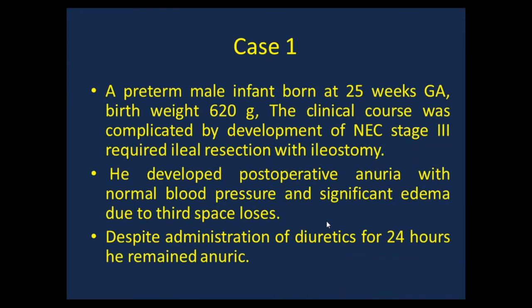So I like this approach. I mean, do you think that will address the criticism for abdominal NIRS? Many times people say with abdominal NIRS, you don't know what tissue you're measuring, right? And that's exactly the common criticism, right? Yes. So we are compensating for that, because one of the criticisms, as you mentioned, is that when you apply NIRS, you are not sure if the NIRS infrared wave is passing through poop or fluids or peritoneal fluid. You have to be sure that the ultrasound is giving you an impression that you are exactly over the tissues and you are evaluating real tissues.